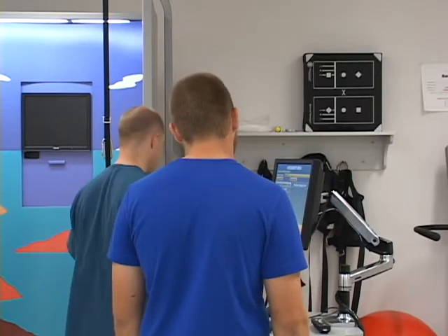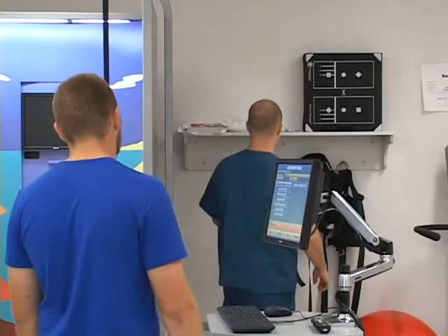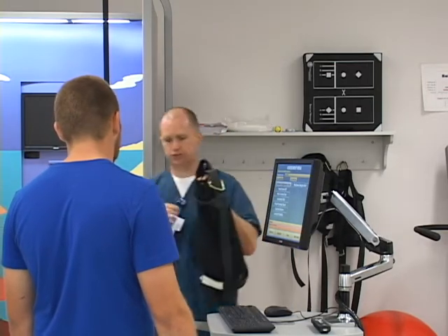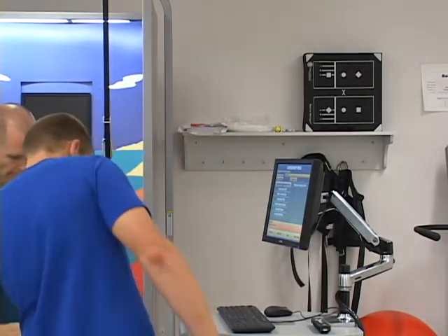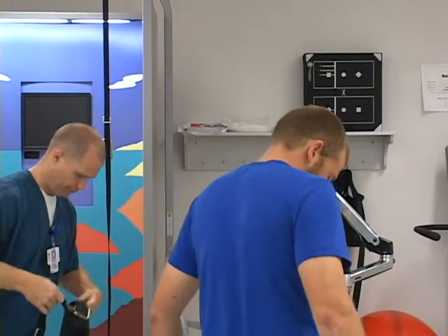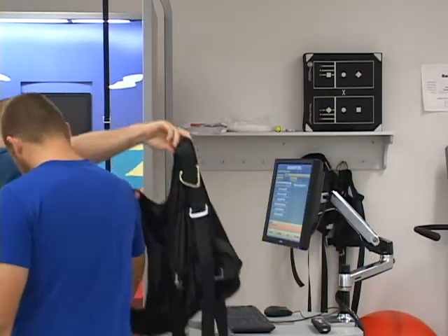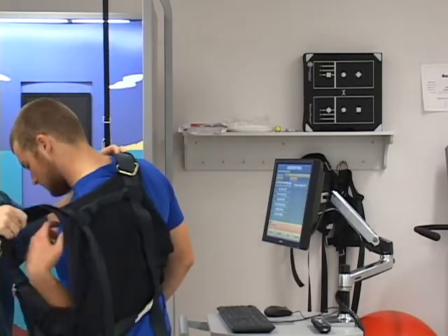This machine is an outgrowth of research that was heavily funded by NASA back in the days just before the space shuttles were going up. What it looks at is the interconnection between the various components of balance — partially the inner ear, vision plays a large part in it, and it also has a lot to do with position sense. You actually kind of feel where you are.